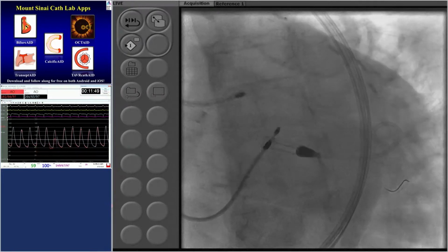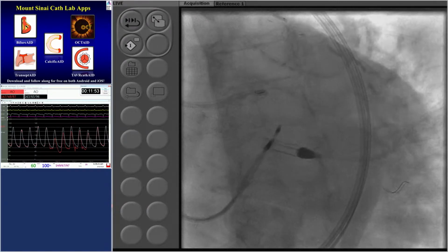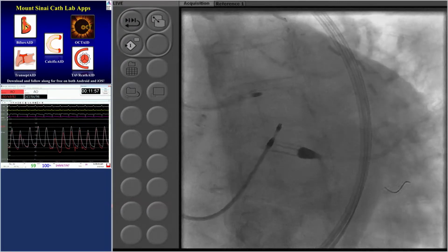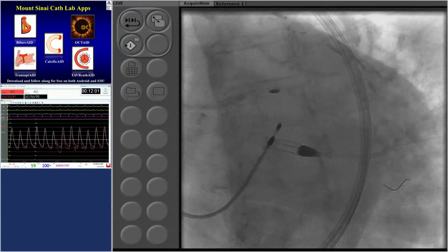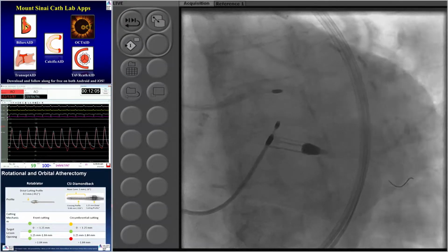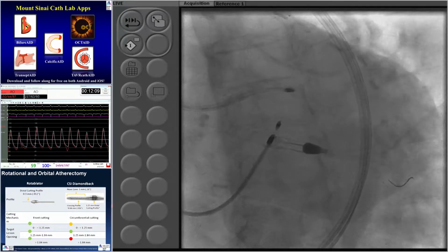Now the question was, we didn't use an Impella in the previous case. This patient has ideal body weight and good vessels, which also prompted us to use an Impella, but you're right. Is it absolutely necessary by my algorithm? I would say no, but it's not contraindicated. That's the only point I want to make.